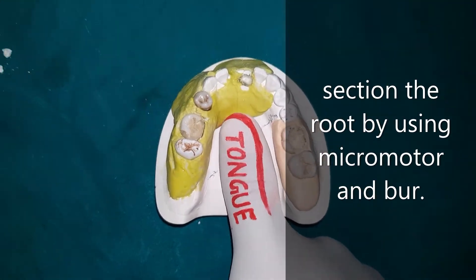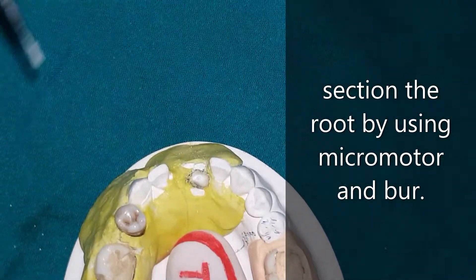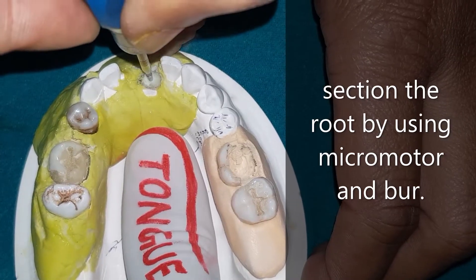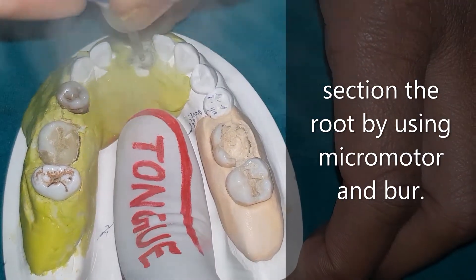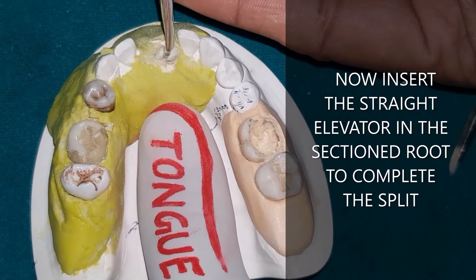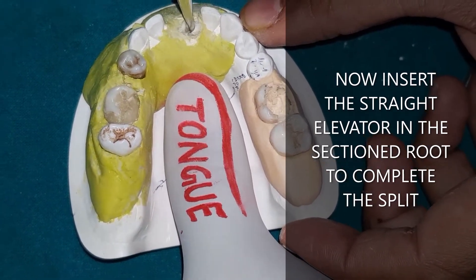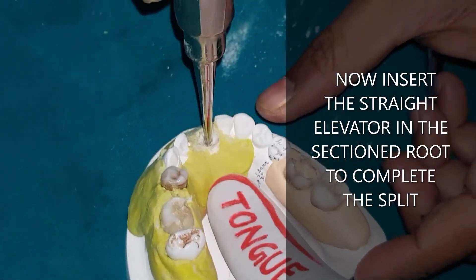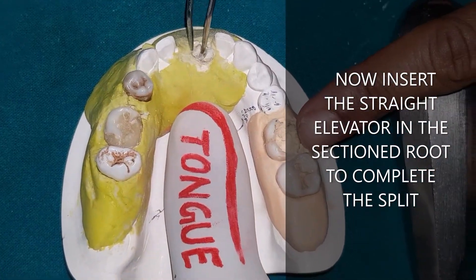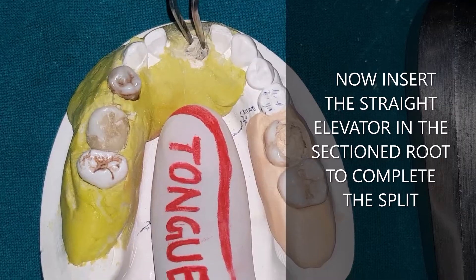Section the root with a bur in a micromotor — creating a punch cut and then completing the section down to the tip. Now place the straight elevator or luxator into the sectioned part and split it completely. Once the split is complete, you can remove both pieces — two, three, or four pieces — separately. This is how you preserve the bone and remove the root without harming the bone.